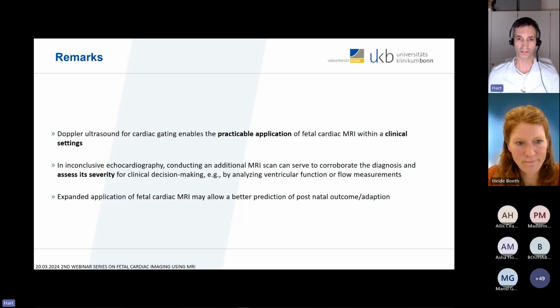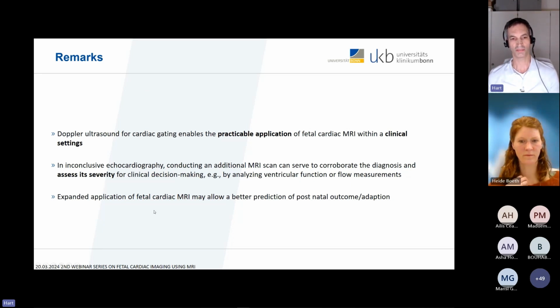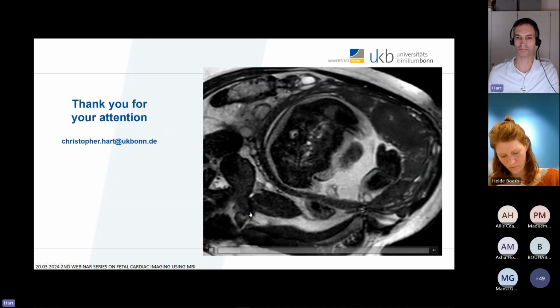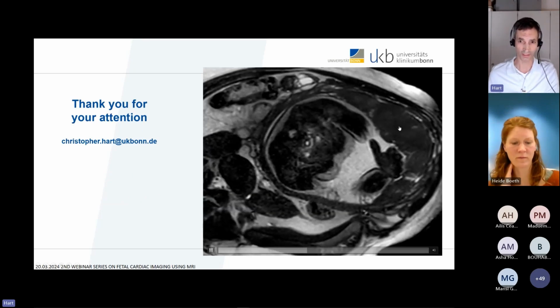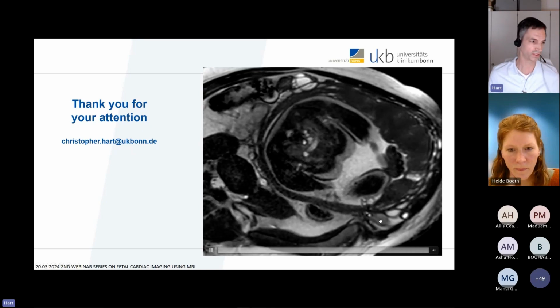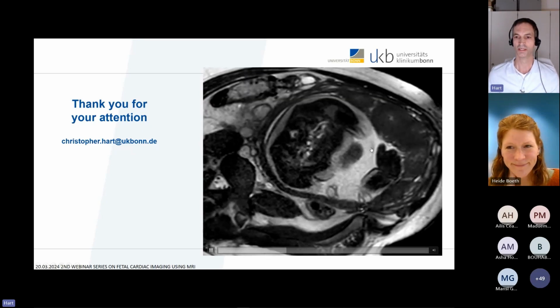We have scans and sequences that we can have a look at right while we are scanning and react on what we see. And I think we are on the best way to expand the application and allow a better prediction of postnatal outcome and adaptation. So thanks a lot. And I just have an image here. You see what our fetuses think of our cardiac fetal MRI program.